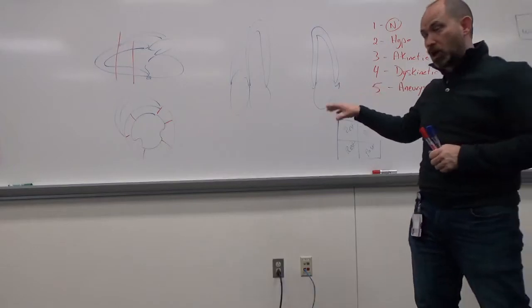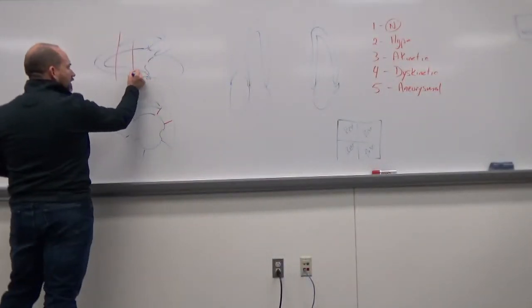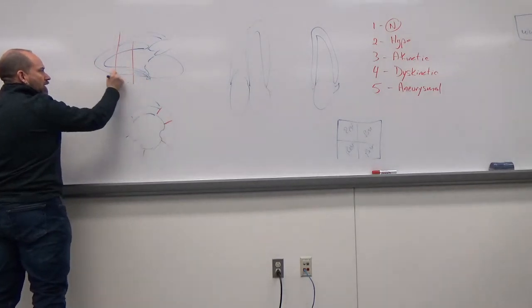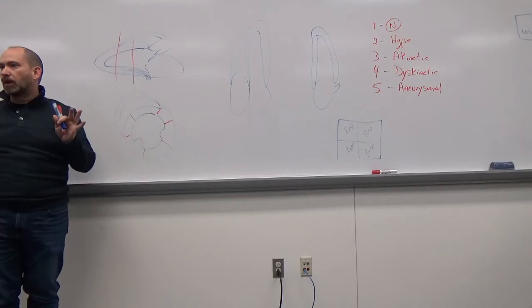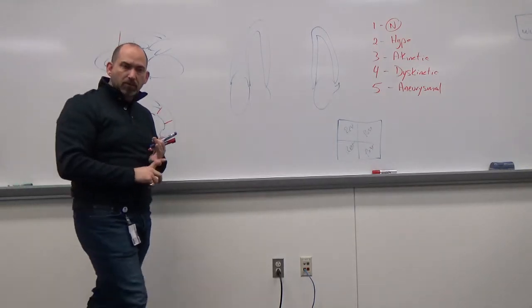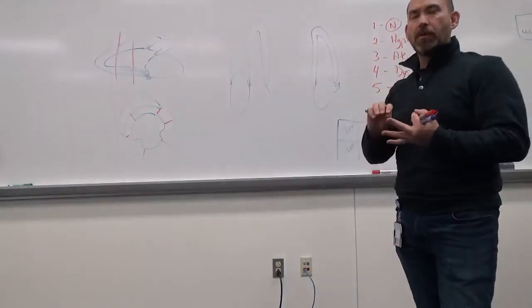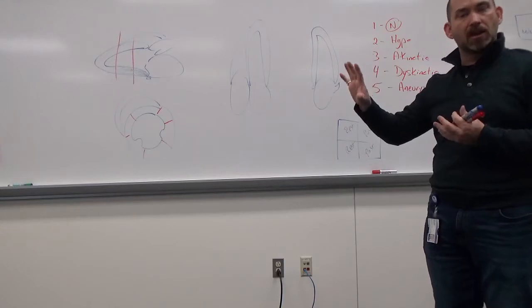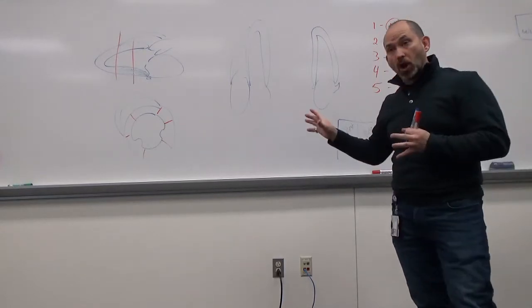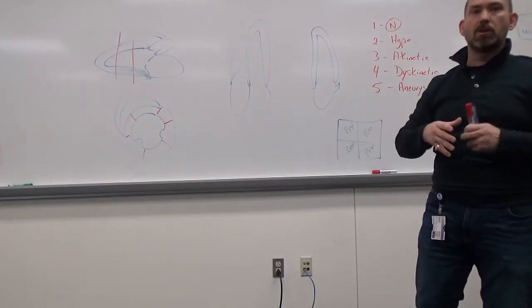So what we do want to know is, say this wall here was all akinetic, and that's stable. If somebody's had permanent scarring, it's going to show up as a very thin wall, less than 6 millimeters, and it's going to be bright, and it's not going to be thickening. That's a scarred akinetic wall. What we don't want to see is that area now expanding and growing.